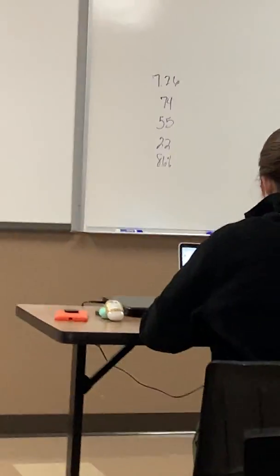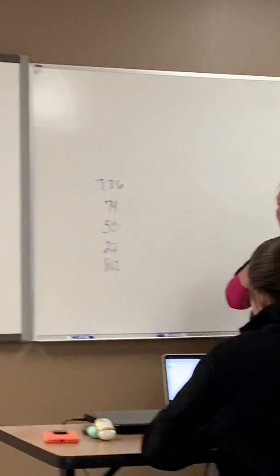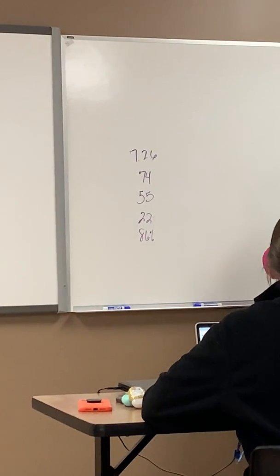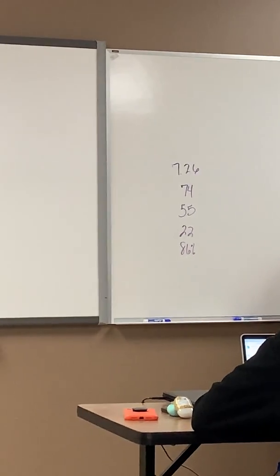Well, I want to ventilate the patient, but are you asking what mode we're on? Do we know that yet? Just based on what you see here. Okay. Is that an oxygenation or a ventilation problem? It's a ventilation problem. Okay. So absent other information, what would you change?